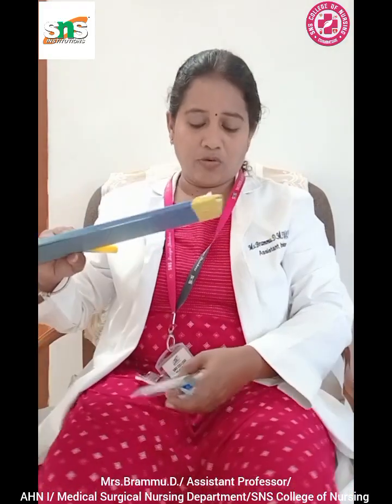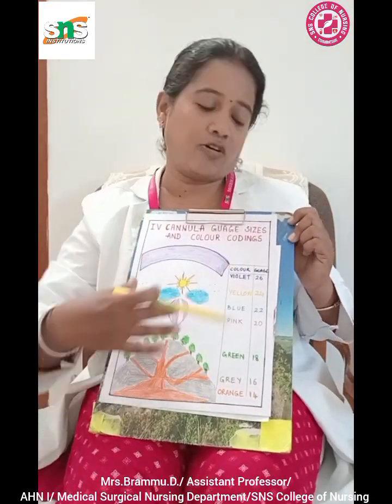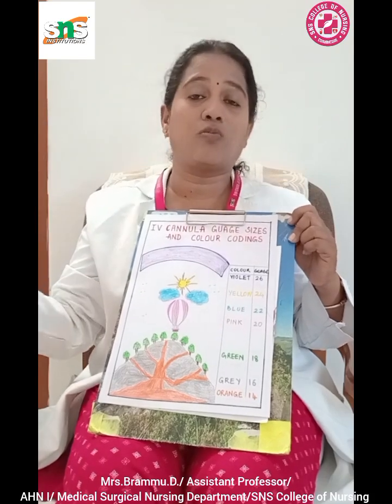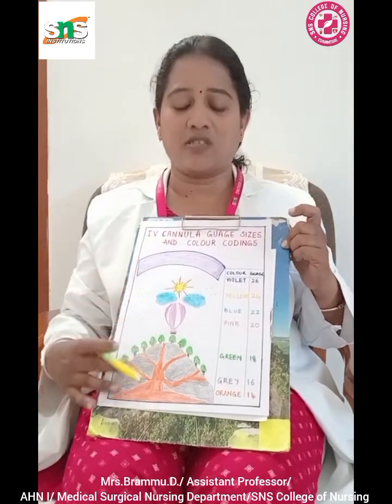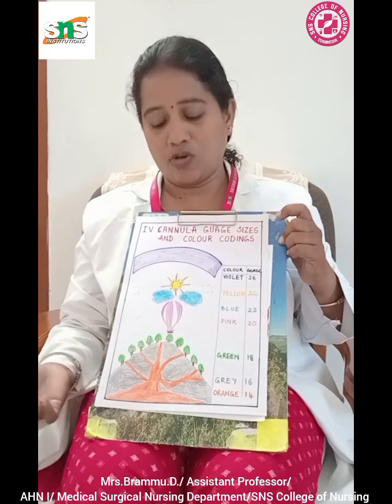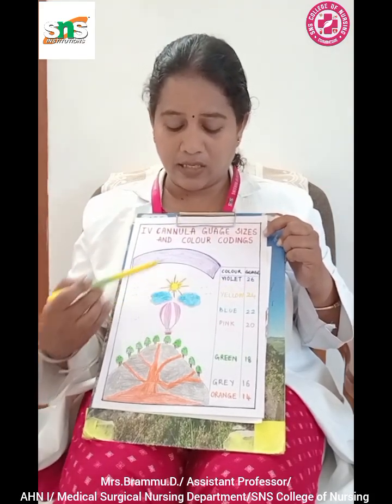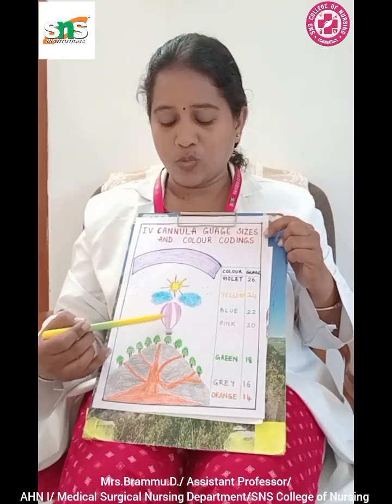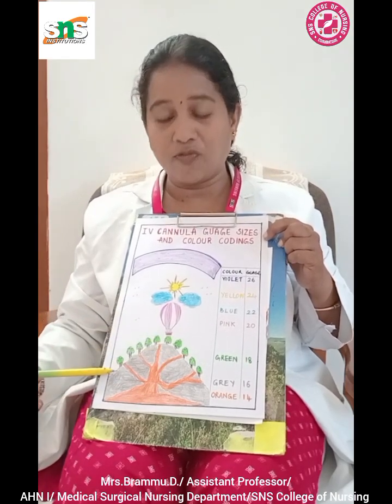So like that you have different color codings in our daily practice, and I would like to show you a few. This is a small mnemonic on how you can keep in mind which gauge has which color. It is a small structure of a sky along with the sun and the skies, and you have the night as well as a hot air balloon, followed by the deep deciduous forest.